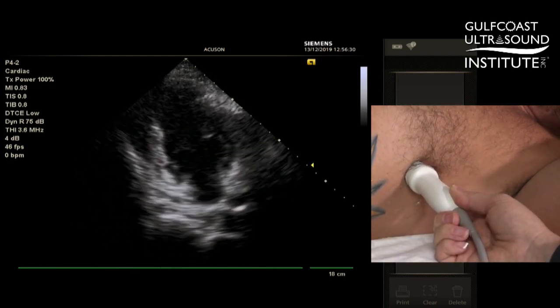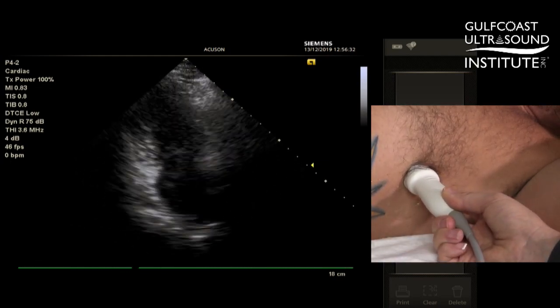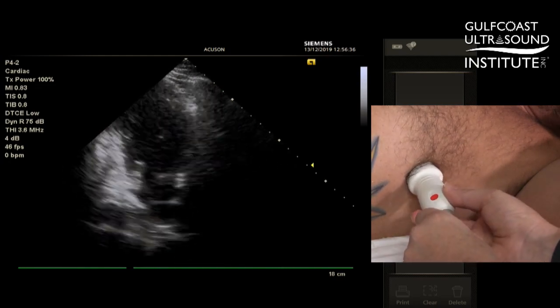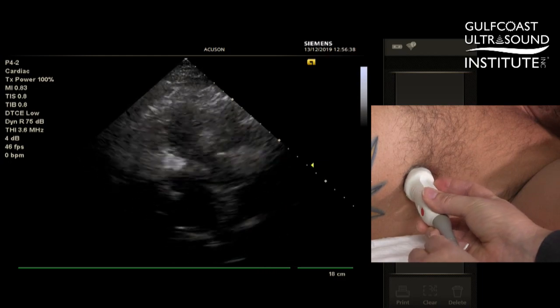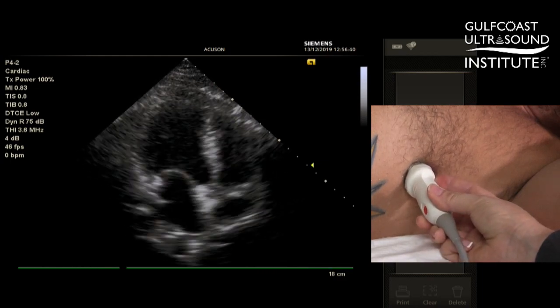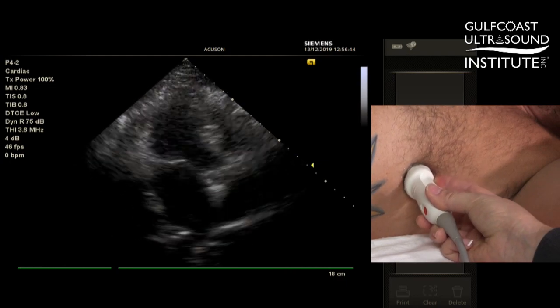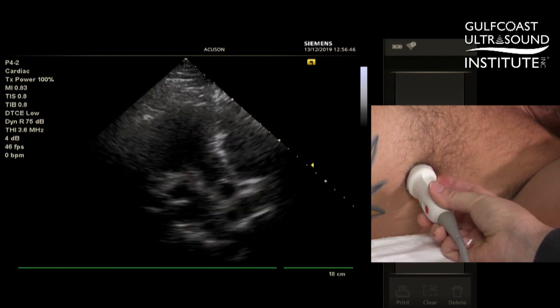From there, one-quarter turn again to the left, tuning in your next view, is the three-chamber view. We know we're in the three-chamber view when we see the LVOT going into the left ventricle.